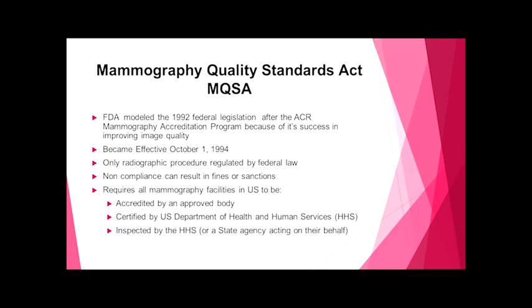So all of these things have to occur for a facility to be accredited. Now, there are some states that have been recognized as accrediting bodies. Texas is one of those. Iowa is another one. Arkansas, and I hope I'm not forgetting one, but I know for sure those three.